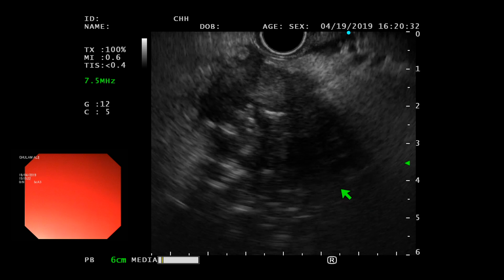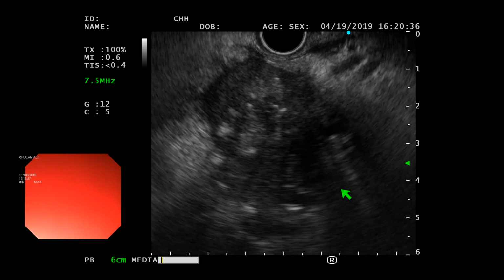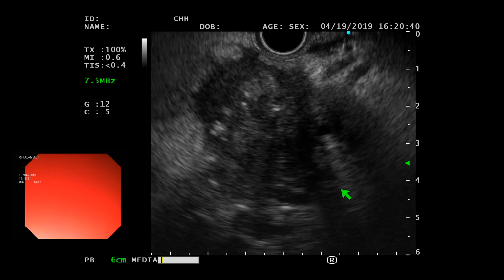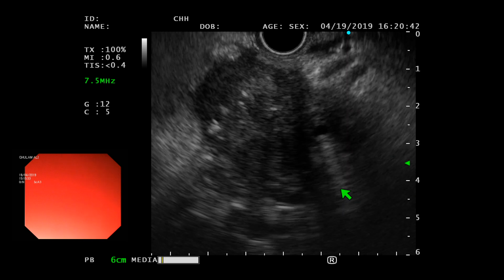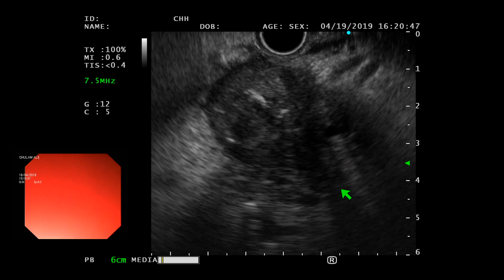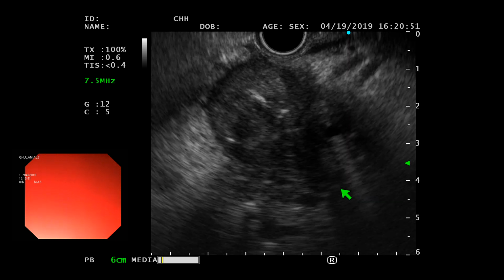Khalid, do you think that there's some neoplastic process in this? I am very worried about that, to be honest with you. Yes, it is, quite irregular. It's a little more organized here, hypoechoic, organized. It could be an inflammatory process, but without FNA, I cannot tell you that there is nothing hiding in there.